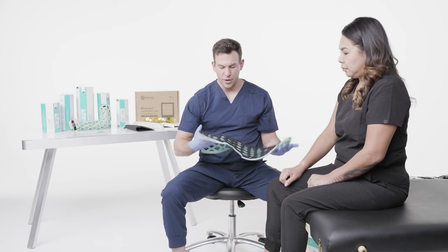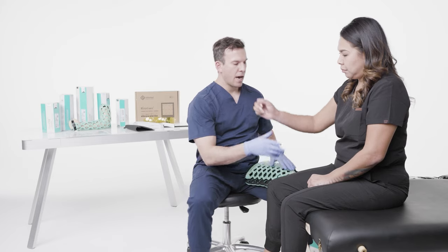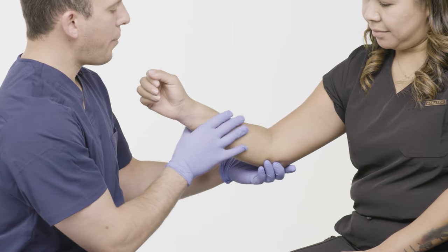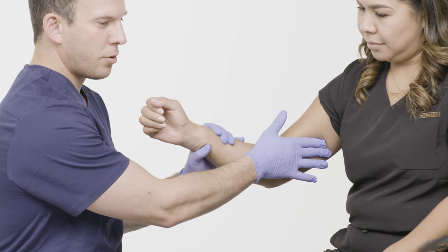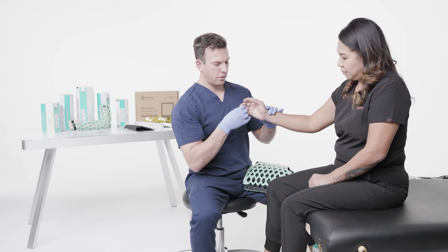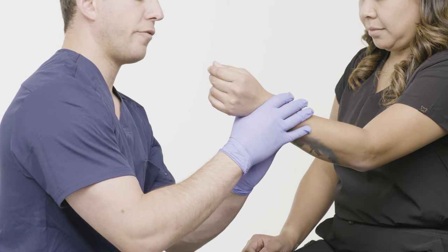Before I apply this, I want to make sure that I inspect my patient's skin and there are no issues. I palpate, making sure she has a brachial pulse, a radial pulse, and a cap refill. I always check bilaterally to make sure she has adequate blood flow.